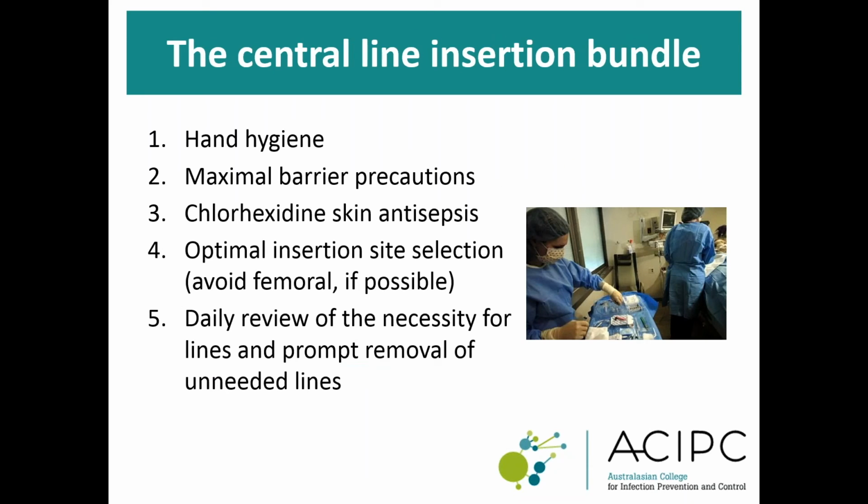A bundled approach to IV catheter management has been repeatedly proven to standardise care and improve patient outcomes. A bundle is a small set of evidence-based interventions for a defined patient population and care setting that, when implemented together, result in significantly better outcomes than when implemented individually. This means that bundles are designed to be used in their entirety.